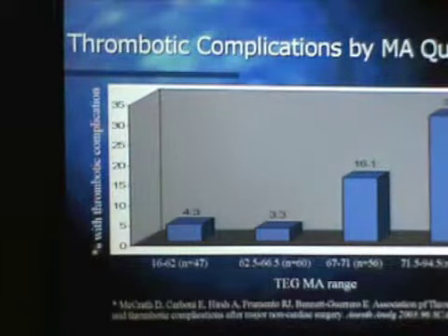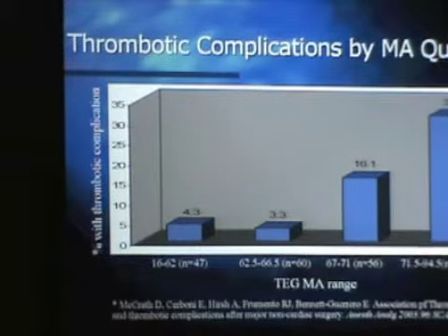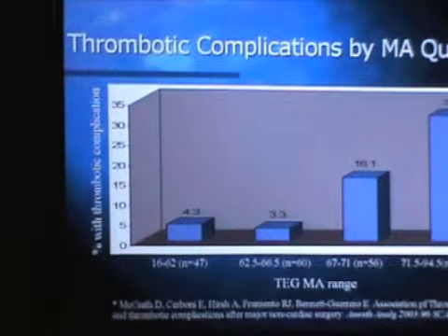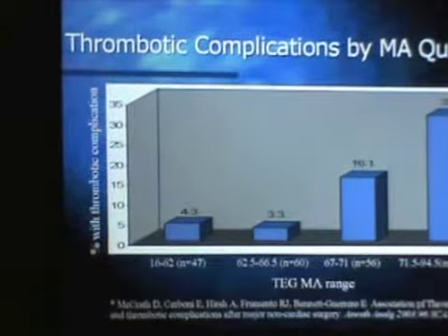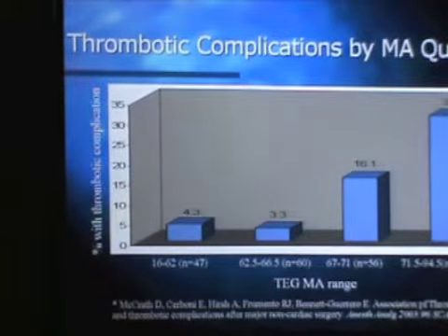Now what's interesting about this is McCrath is a non-cardiac anesthesiologist. And he did this on 400 and some odd non-cardiac patients. Now Paul Goebel, who's an interventional cardiologist, conducted the same study on his patients post-stent. And the beauty about Goebel's study was he came up with the same data. 70% predictability in the third and the fourth quartile.